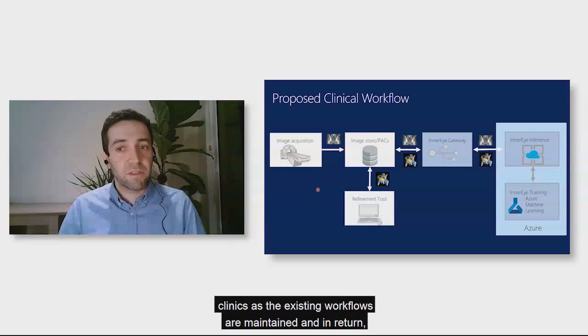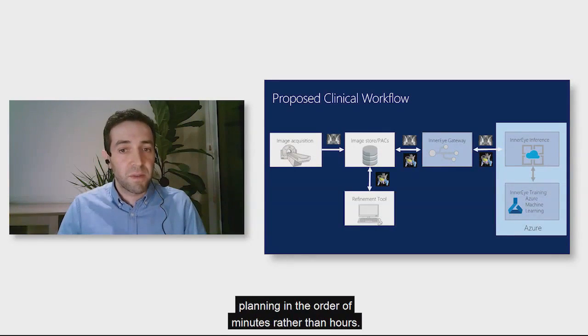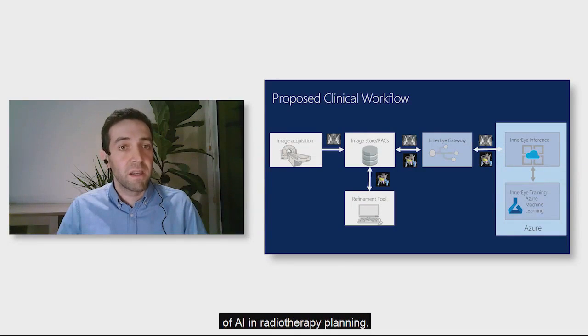which makes this technology more accessible across clinics as the existing workflows are maintained, and in return, the required contours will be available for planning in the order of minutes rather than hours. And lastly, it is important to note that this is not a clinical product, but a research study in machine learning and healthcare domains to check the feasibility and potential benefits of AI in radiotherapy planning.